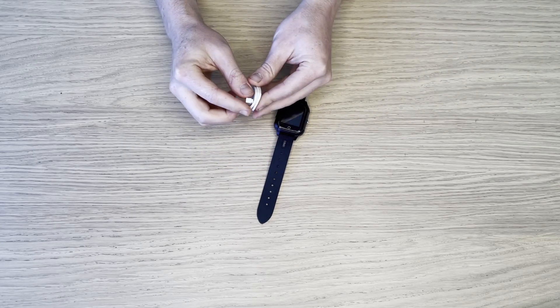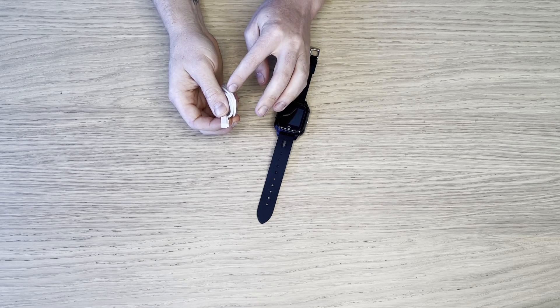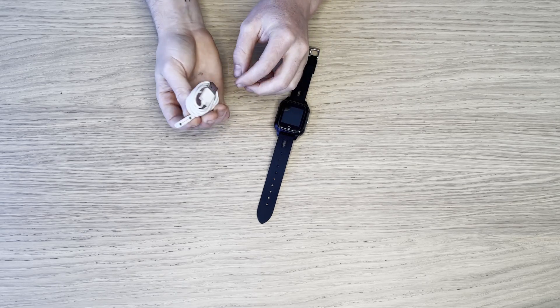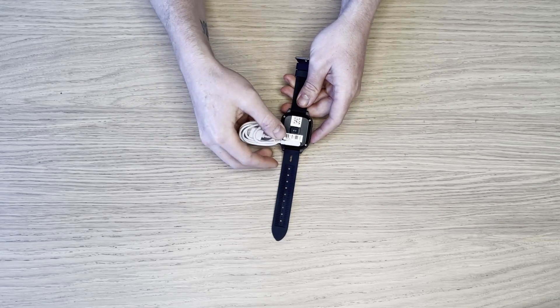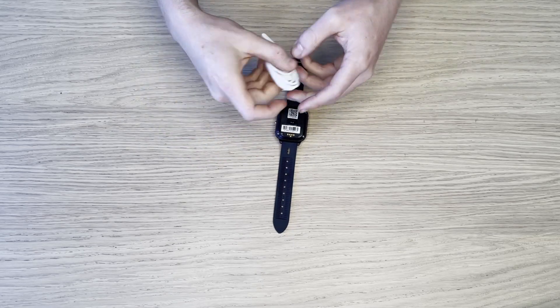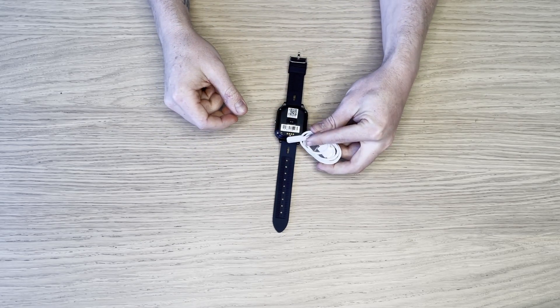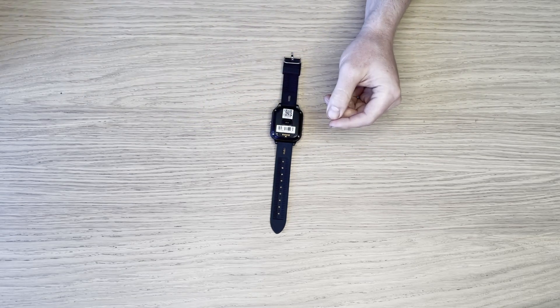And most importantly, the charging cable. This will attach to a 5 volt, 1 or 2 amp power adapter via USB, and it will only go on one way. It's got two magnets and it will click on. If I try and do it the other way around, it will not attach. I really love that.